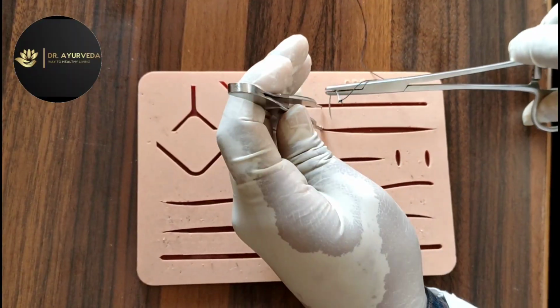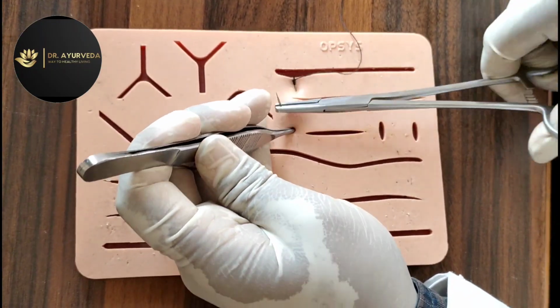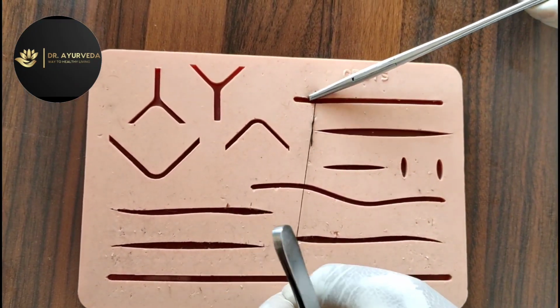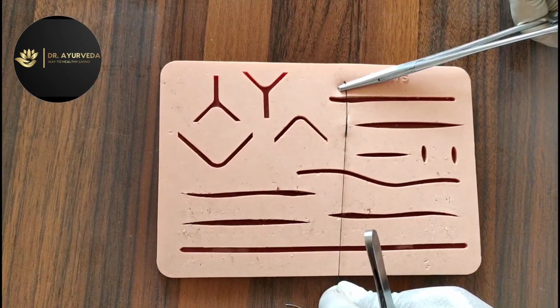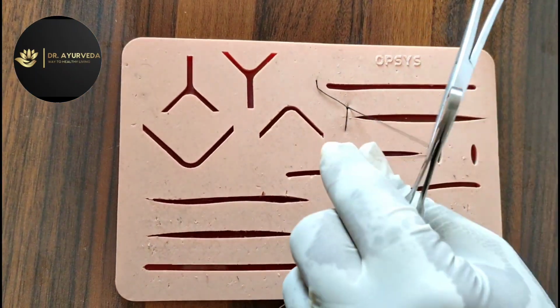It is a suture technique that provides closure of the wound with a single suture. It is similar to the simple interrupted suture technique. But unlike simple interrupted sutures, knots are not tied at every stitch. Only the first and last stitches are fixed by knotting. It is an easy to apply, frequently preferred suture technique that provides eversion.